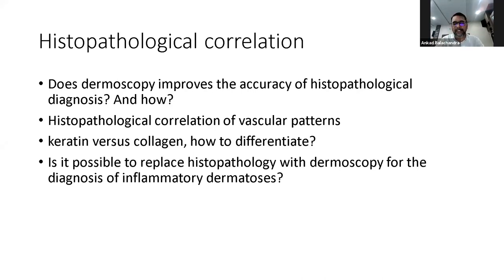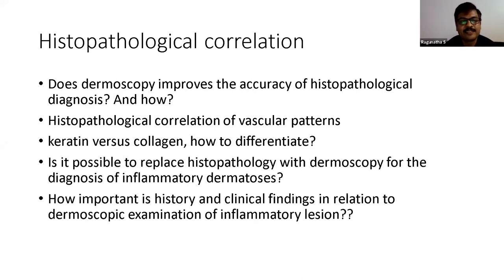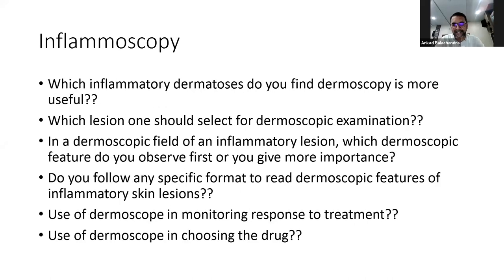Yeah, I totally agree with Nikam sir. Histopathology is the gold standard, so there is no replacement by dermoscopy. Dermoscopy is an additional tool. And how many questions are remaining, Raghu? It's almost time. Last question, please. Just one of the important uses of dermoscopy, what I feel, is monitoring response to treatment. I would like Dr. Enzo to comment on this. So, do you use dermoscopy for monitoring the response to treatment in inflammatory dermatosis?